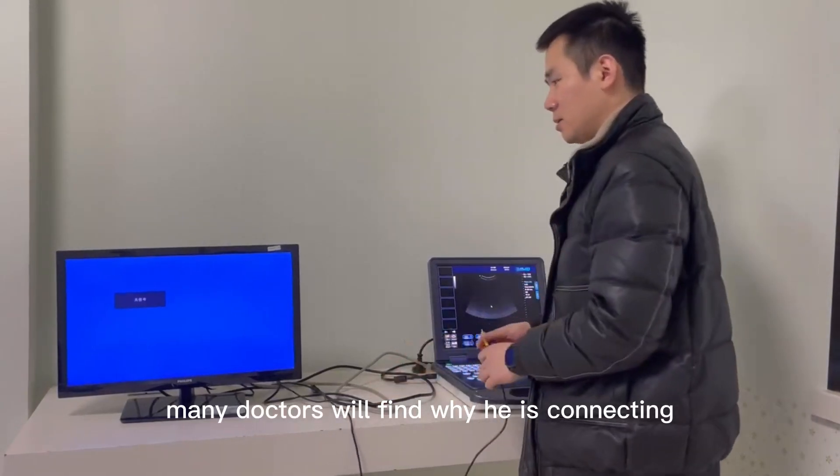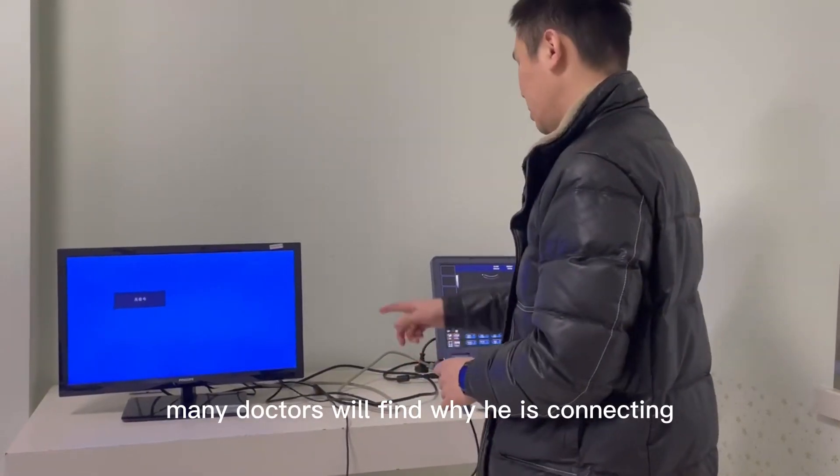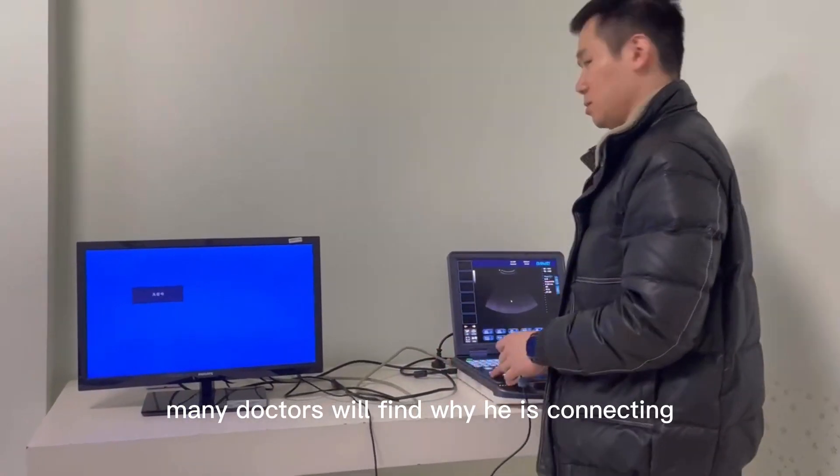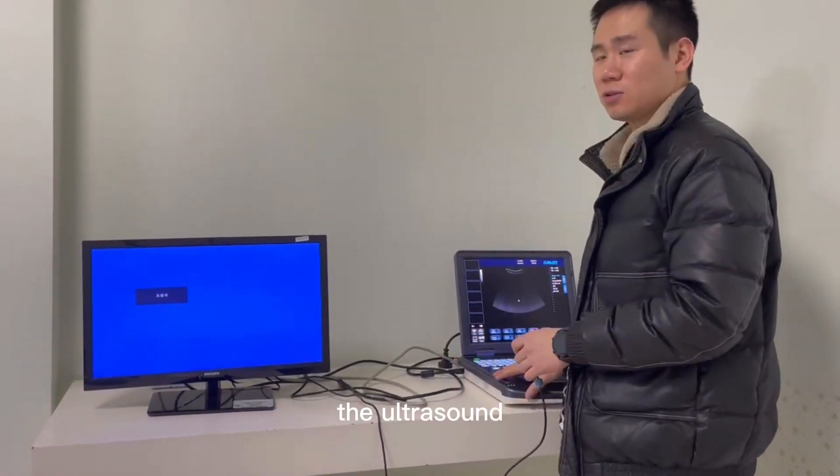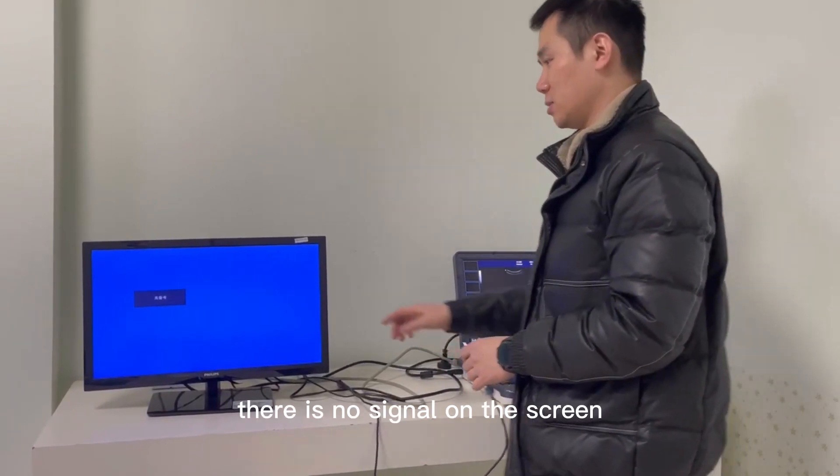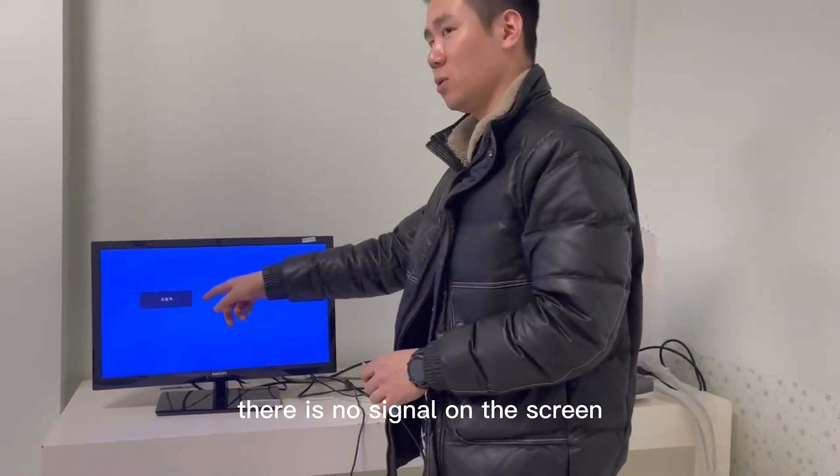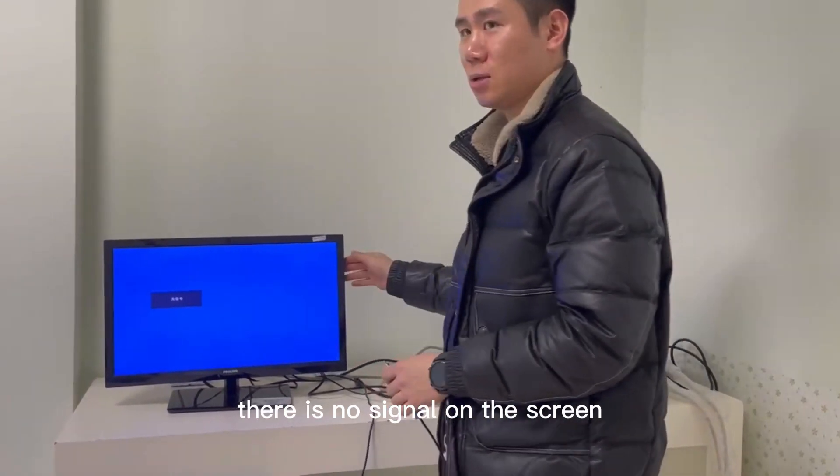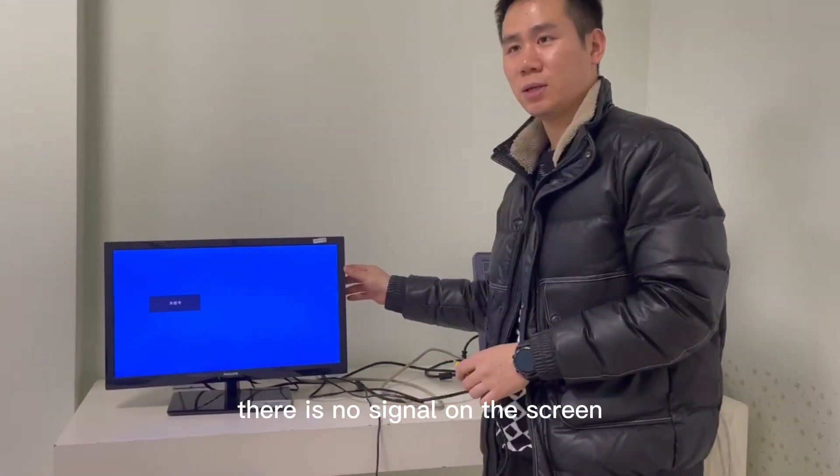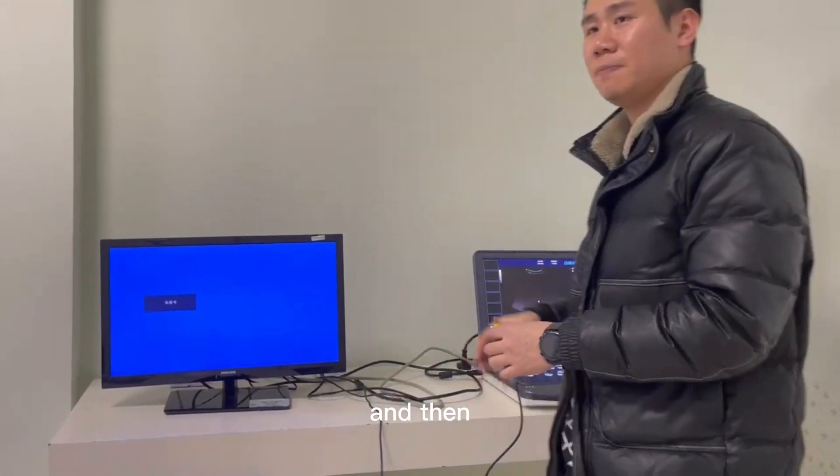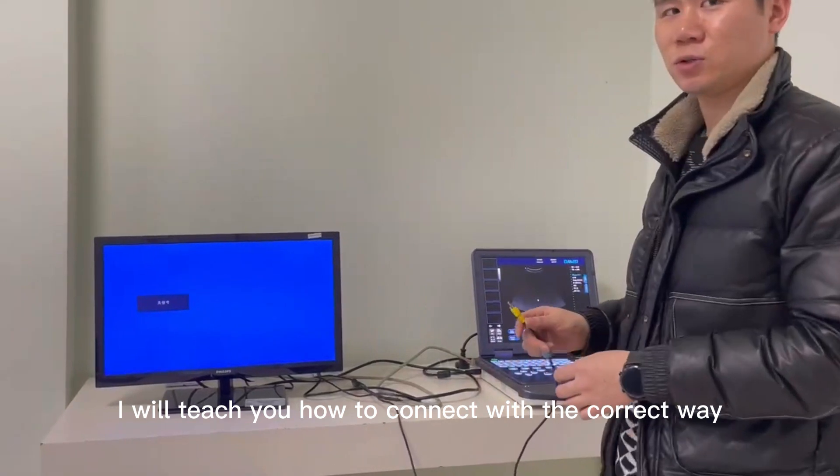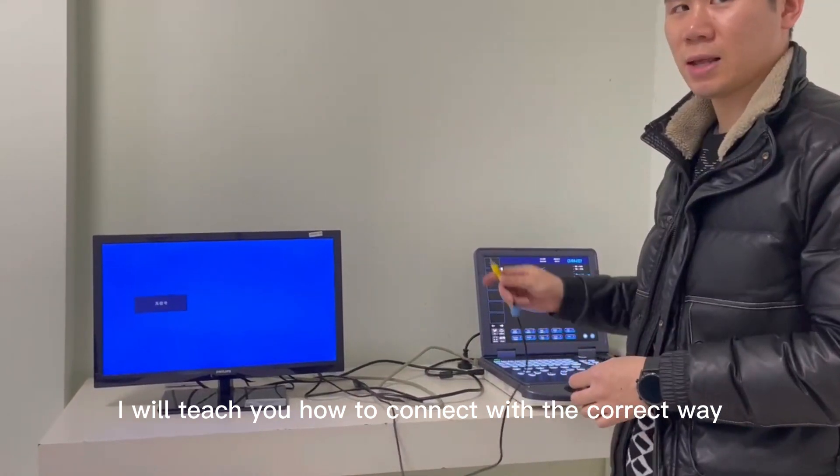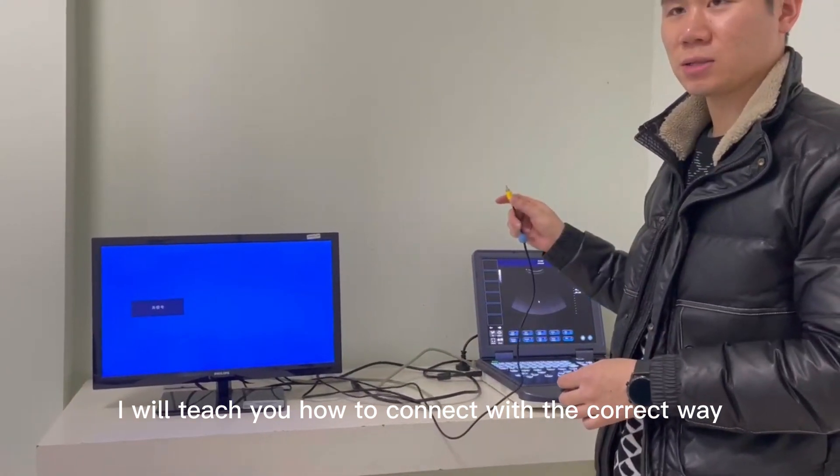Many doctors find when connecting the ultrasound, there is no signal on the screen. I will teach you how to connect it the correct way.